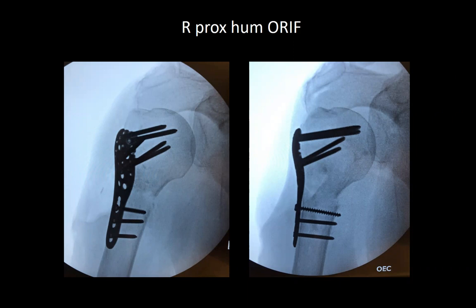Jeremy, you mentioned those other alternative treatments, percutaneous pinning, which you couldn't get reduced, and then also intramedullary nailing. Now that you know what you know about the bone quality, how would those other alternatives fare in that setting? Probably not great. Knowing all that we know now, this is probably the best option we had, with potentially the adjustments we talked about. Yeah, and that's the thing to think about: this is probably your best chance at decent fixation or somewhat terrible fixation. Yeah, fair.